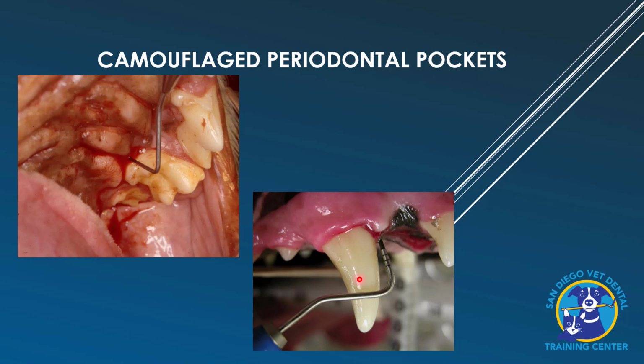Examples, really quick, simple examples. Beautiful, happy, healthy gums. Look at that, no tartar, 9mm pocket. Again, beautiful, happy teeth, no inflammation, 11 millimeter pocket. This tooth has actually got a class 2 perio-endo lesion on it. It's not loose because it's being held in by these mesial roots. Now, if you wouldn't have probed, you would have missed these.